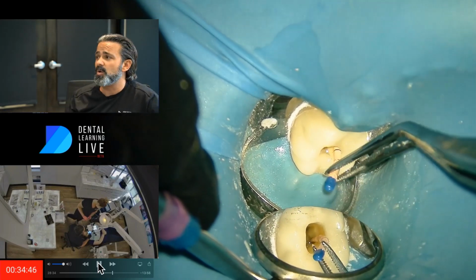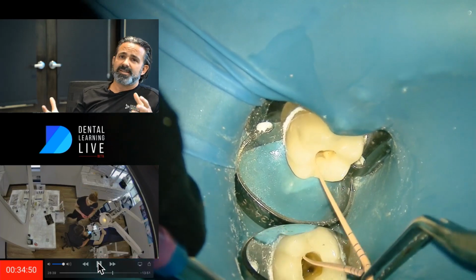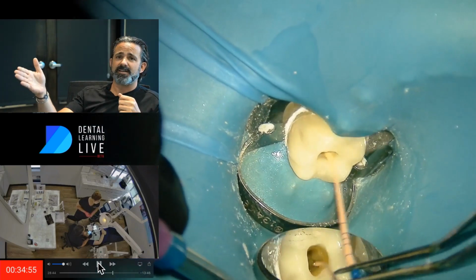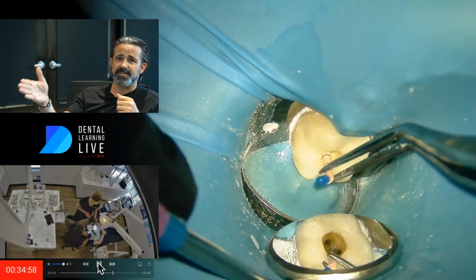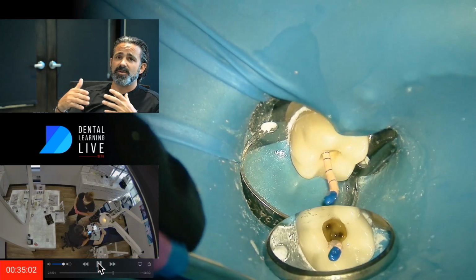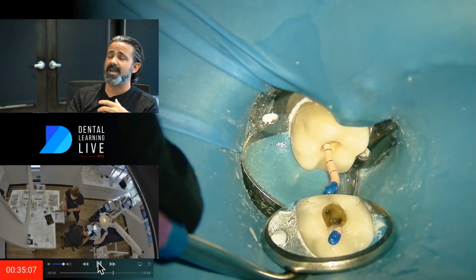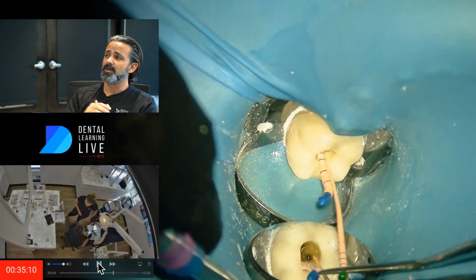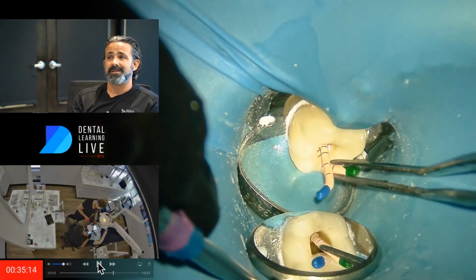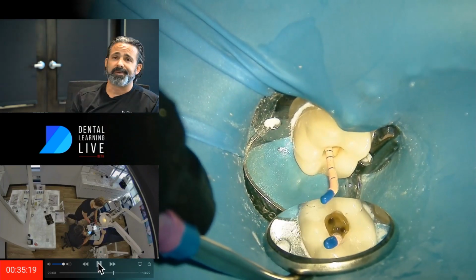And I'm going back to my cones that I did, and I'm going to see if anything enlarged, because like I said, when I did my first working length, I still had gutta percha. I could put a 35 cone in that distal, but I still had gutta percha on the walls. And now that I've run the GentleWave, if I wasn't 100% perfect in removal of that material, maybe something falls down and my cones don't go to length at this point. Or maybe I dislodged something with the GentleWave and it's there. Or maybe it actually dissolved out something and it made it a half step larger from like a 30 to a 35.